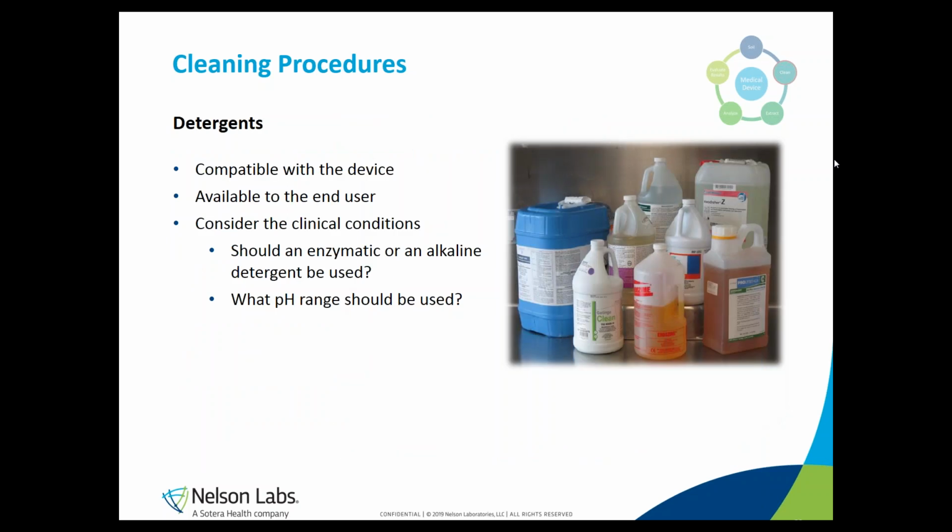The choice of a suitable detergent is very important, and you should always keep in mind that the detergent chosen for a cleaning validation is compatible with your device and is available to the end user as well. When choosing a suitable detergent, always keep in mind the clinical conditions, as they will decide if you have to use an enzymatic or an alkaline detergent, for example, and what pH range should be used.